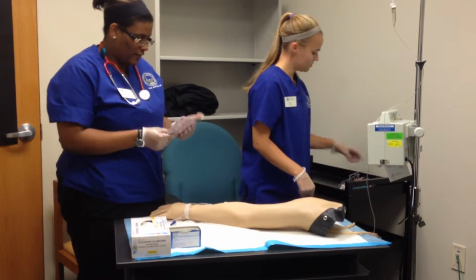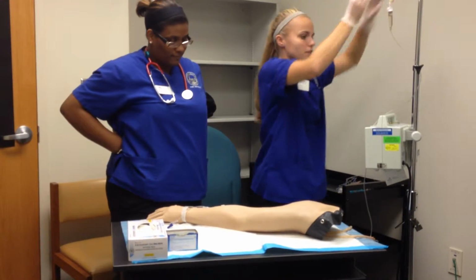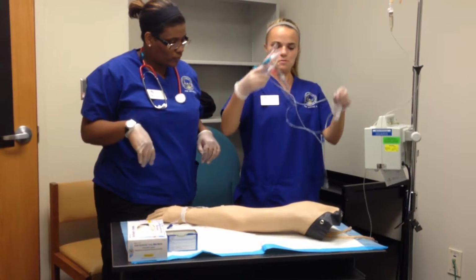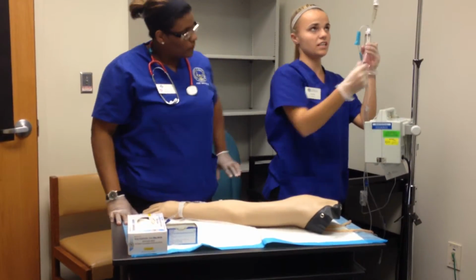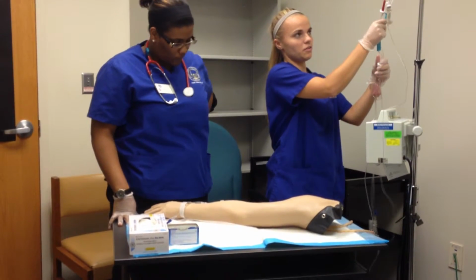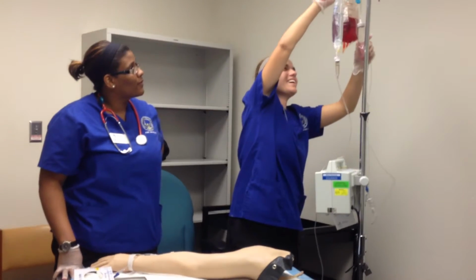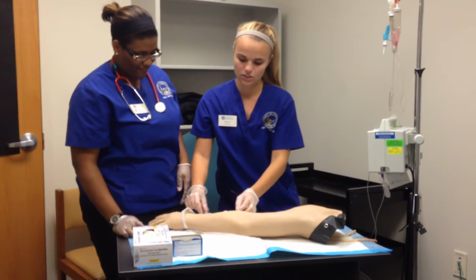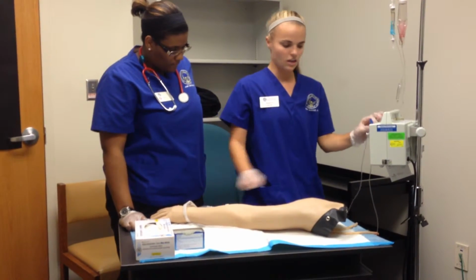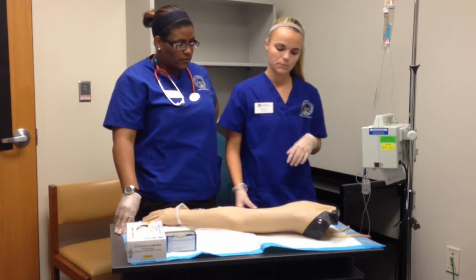Alright. Now we're going to get your infusion started here. We have to use a Y tubing. So we'll prep it and change out the tubing on this normal saline that you're getting already, so they're all together. Then connect it to your IV site here. We're prepping it with an alcohol swab and connecting it in, making sure that it's patent, and hooking it all up. We start slowly at 2 ml per minute, and if there's no adverse effects, we'll increase the rate.